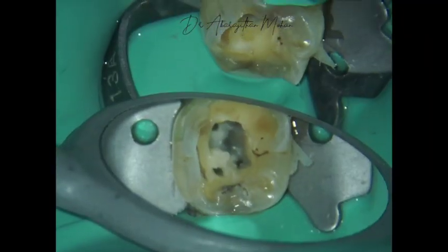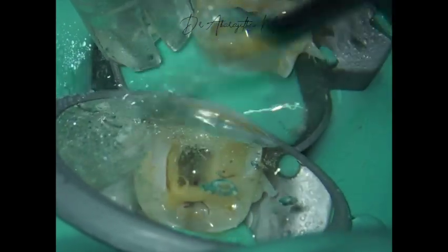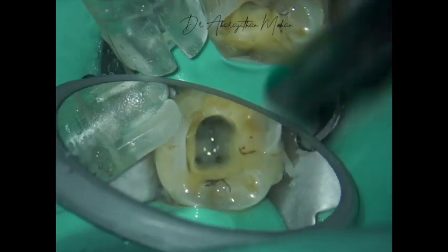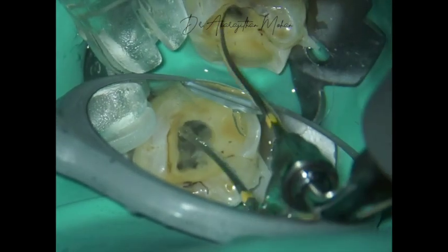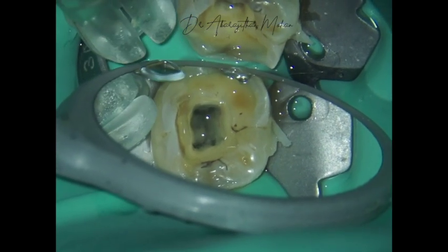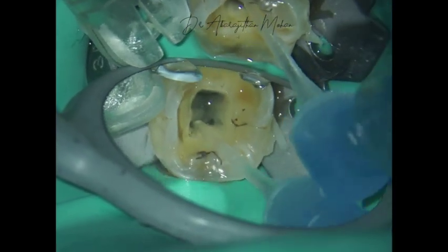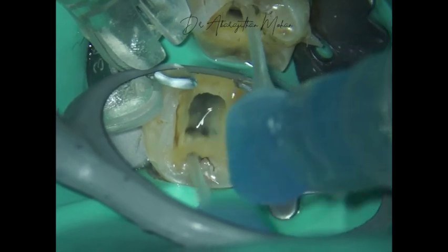My personal workflow: I use normal scalers first to clean the pulp chamber, following which I use continuous ultrasonic irrigation to debride the coronal third. You can see that I'm not forcing them beyond the curve — just trying to be passive. That's one of the limitations with current metal-tipped irrigation devices, which is why we use it just for the coronal and middle third. Following this we use passive irrigation for the middle and apical third.